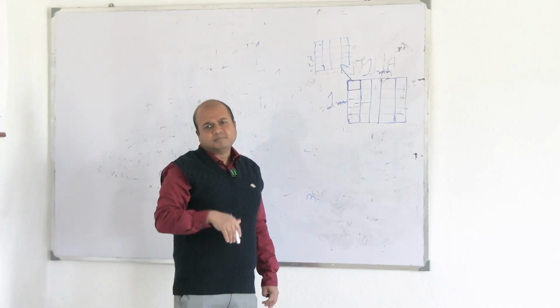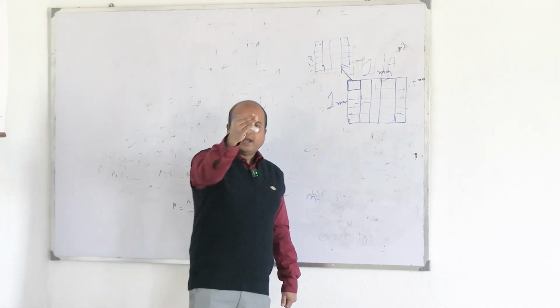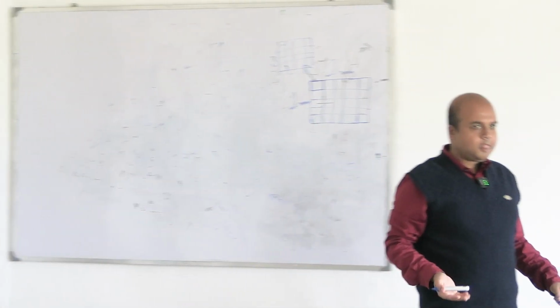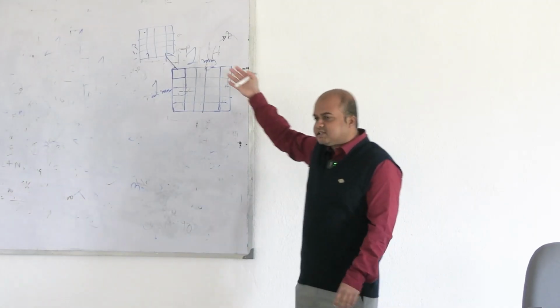In the books it is written small, medium, smallest. Don't confuse yourselves. Write large, medium, small. RBCs have 3 types of squares: large, medium, small. In books it is written smallest. So smallest is obviously smallest, but we can say large, medium, small.